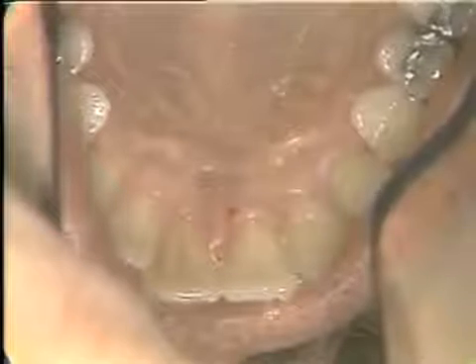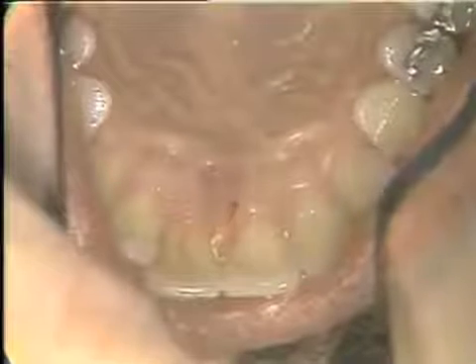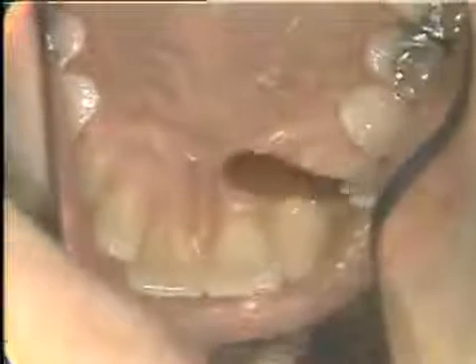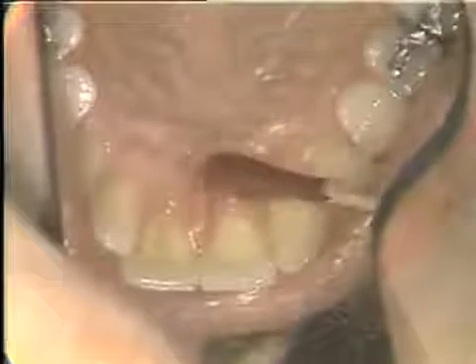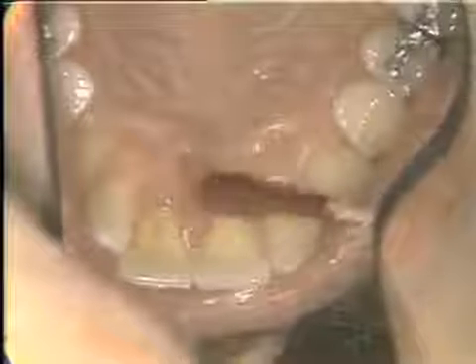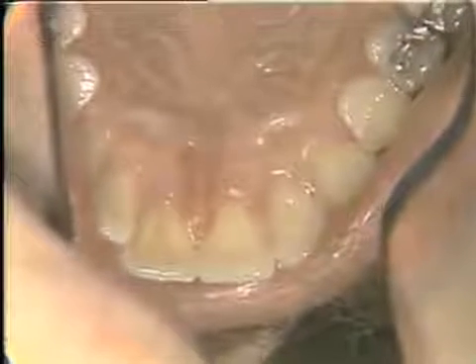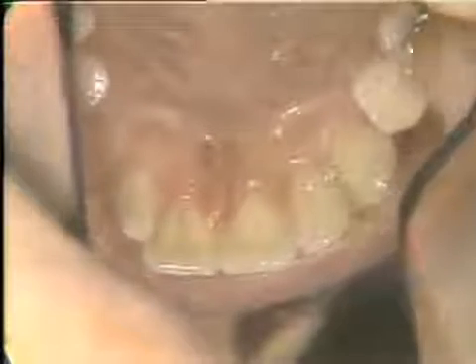This is a mirror view of the anterior palatine area, and you can see the nasopalatine papillae right here very, very nicely. We'll dry our mucosa and apply a little betadine again. And we'll make our injection just on this side of the papillae. It doesn't matter whether you make it on the right or the left, but one or the other. Don't inject directly into it.